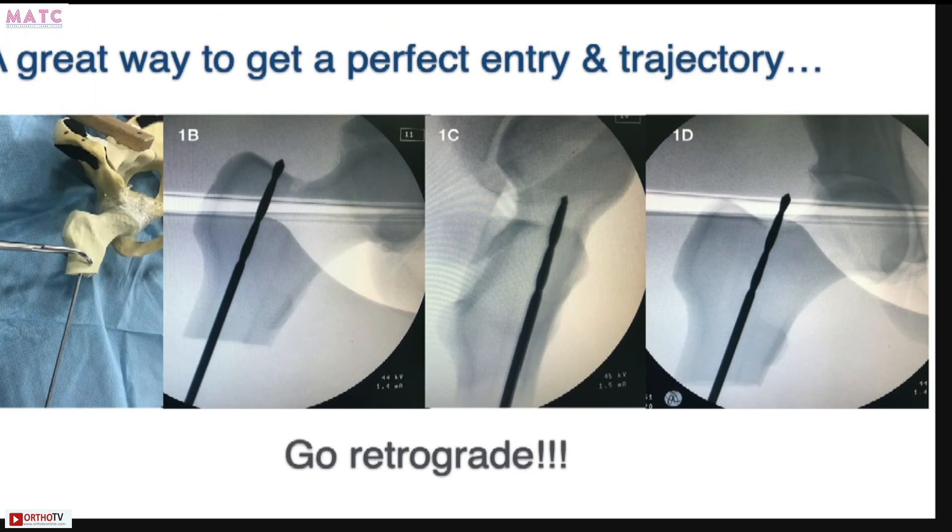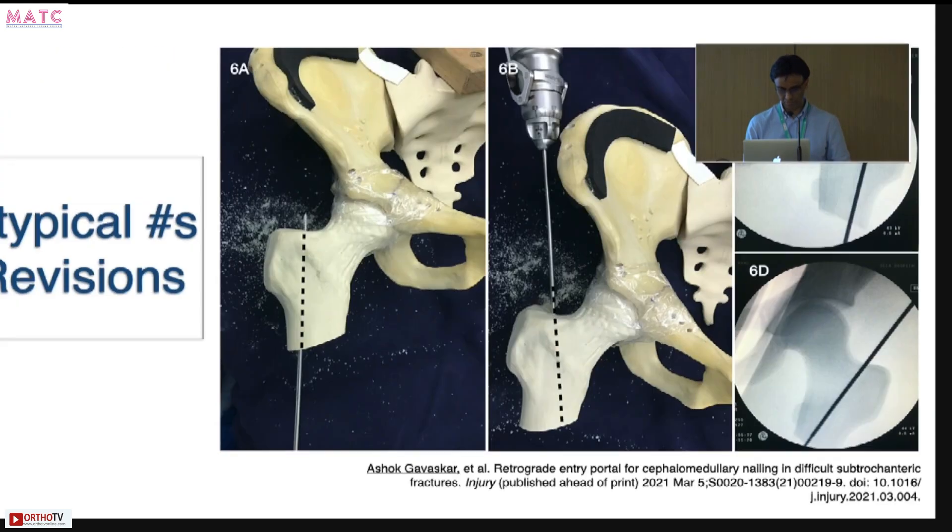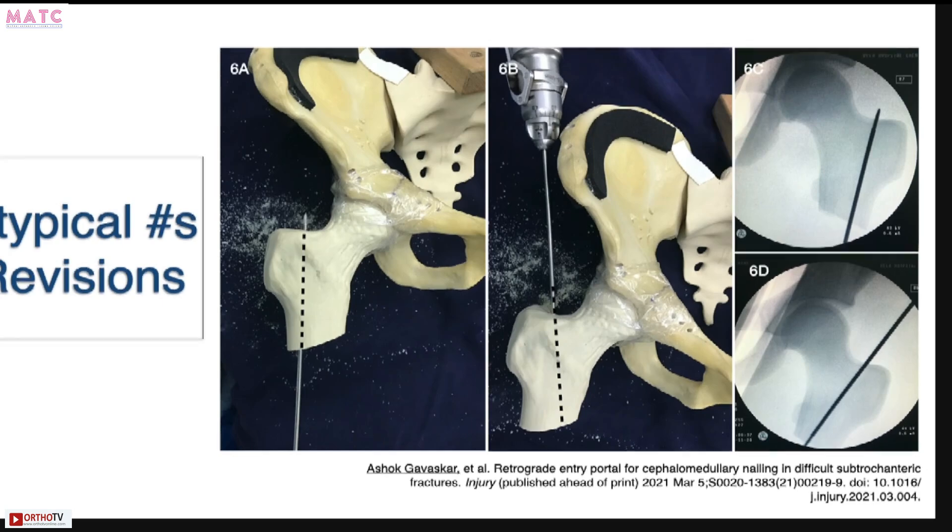Another way is to go retrograde. You can create a retrograde entry portal without reducing your fracture first. Once you pass your guide wire, you can then reduce the fracture and pass your nail from above. We use this in atypical fractures and revision situations — it helps you get a great entry point and an absolutely brilliant nail trajectory. This is not something new; we always used to do it in femoral shaft fractures.